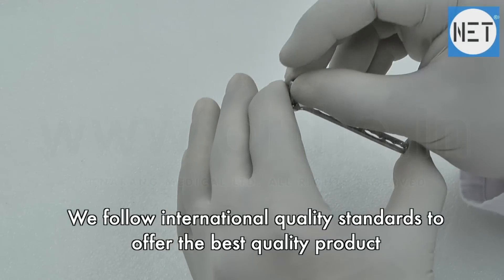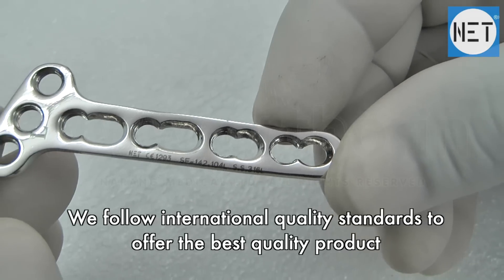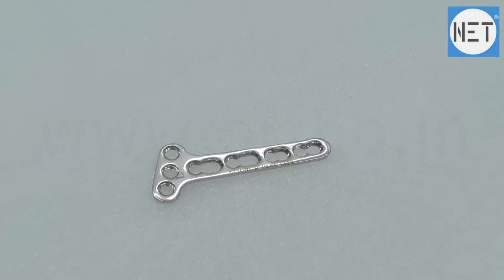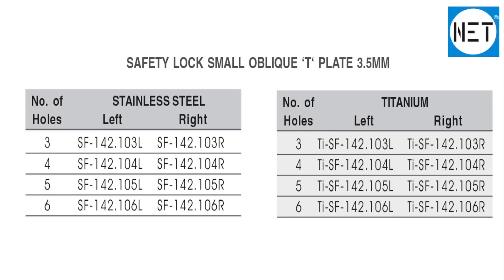We follow international quality standards to offer the best quality product. While manufacturing, every minor technicality is taken into consideration. High technology machines are used for better production and faster deliverance.